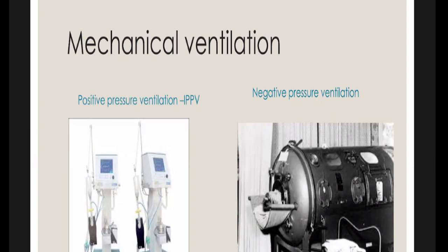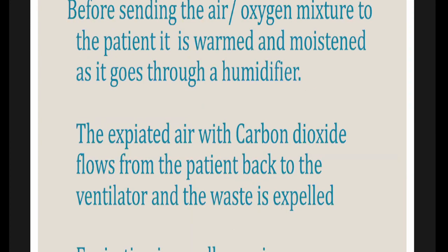But you can also see the size of this. It looks like a rocket, doesn't it? It's so huge compared with our modern conventional ventilators, which are very small and can be nicely accommodated in the little space at our bed spaces in our ICUs. Imagine if we had iron lungs, how big our ICU would have to be. It would be like half of the hospital, because it's so big, right?